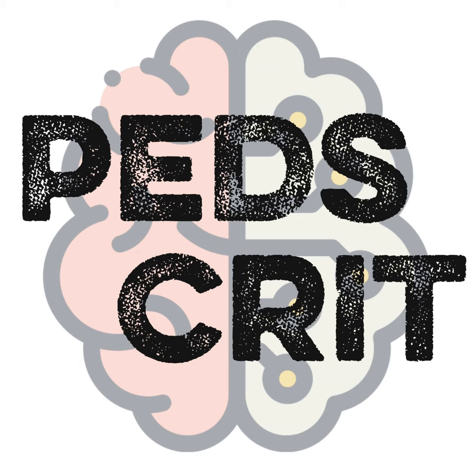Other centers can use plasma filtration techniques. That's also a possibility. So you could have 2 CRRT machines, either in parallel or in series, and you can do simultaneous treatments with TPE and CRRT at the same time. Our center doesn't do plasma filtration. We do plasma separation and exchange using the centrifugal platform, because that's what we do for all apheresis patients.